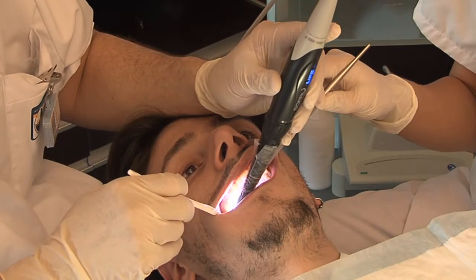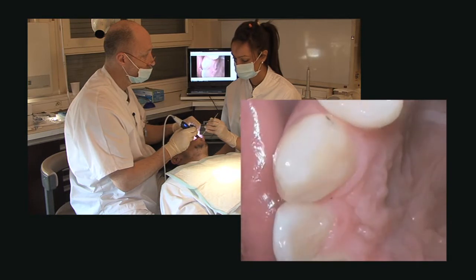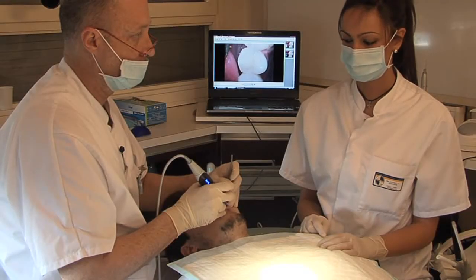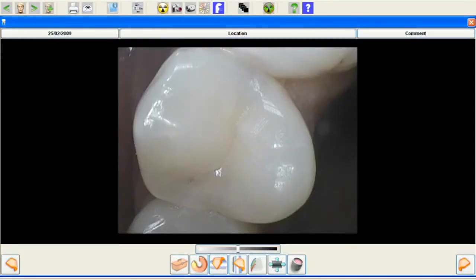Use Soprolife's daylight mode to show your patients the difference between before and after care. Thanks to the sensitive Soprotouch, an image can easily be frozen by a simple touch of the fingertip.